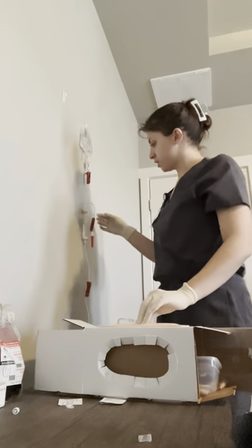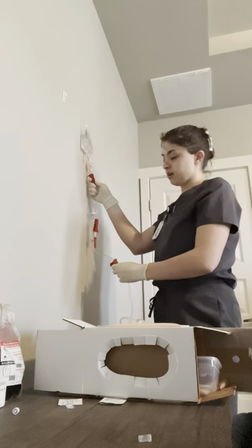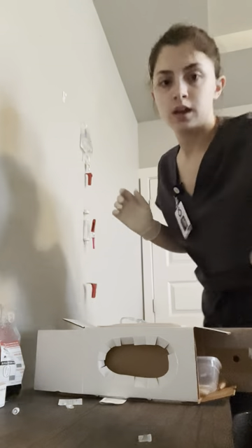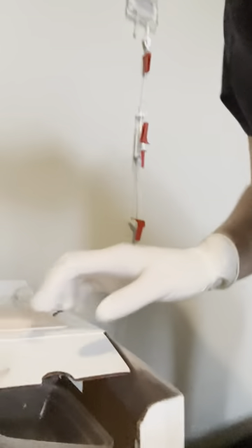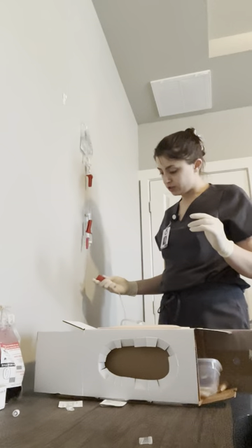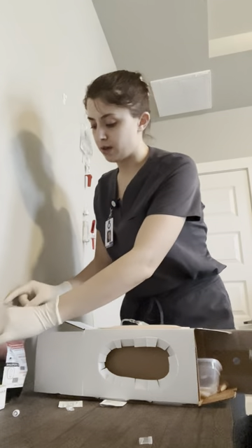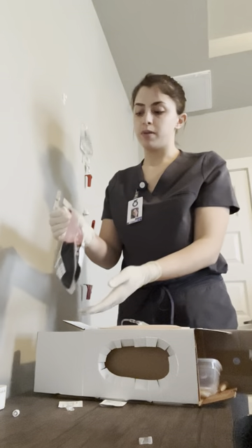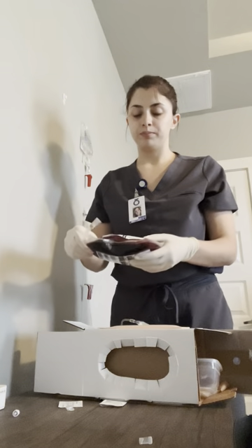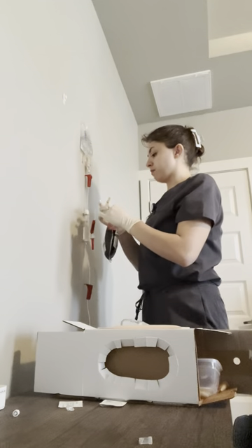Once it is attached, I'm going to make sure that it runs through all the way by unclamping both, and you can observe the dripping. Once I've done that, I'm going to adjust the flow rate to the prescribed flow rate. Then I'm going to prepare my blood bag by inverting it gently, and I'm going to spike the blood bag.